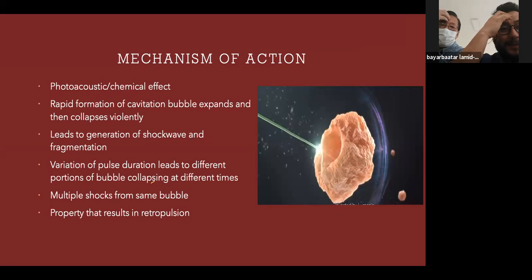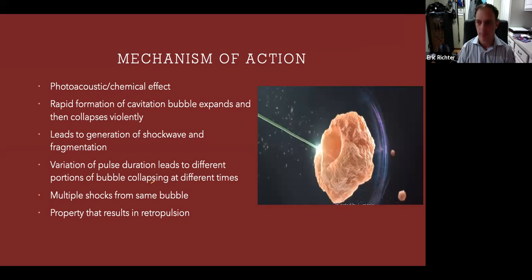A bubble expand, this means like we make a small hole into the stone, right? Essentially, yes. And so the bubble expands, and then when it collapses very violently, very rapidly, that collapse, that loss of space, it expands and then collapses, and that's what leads to fragmentation.